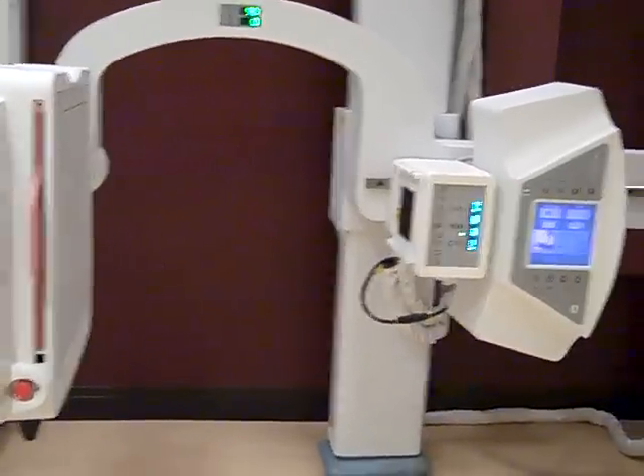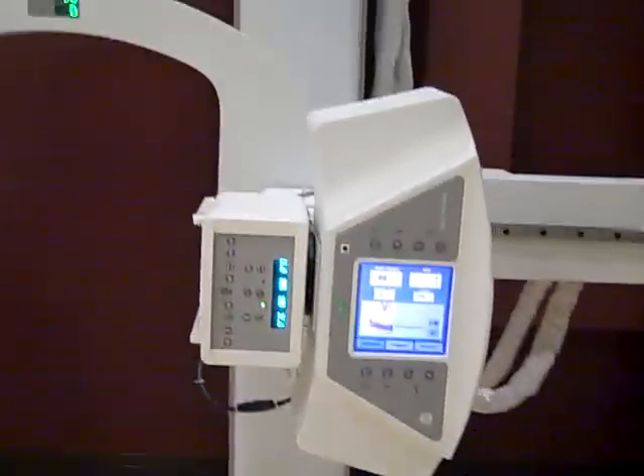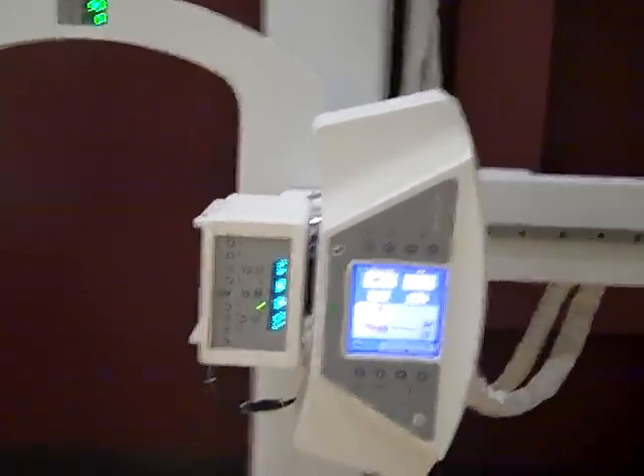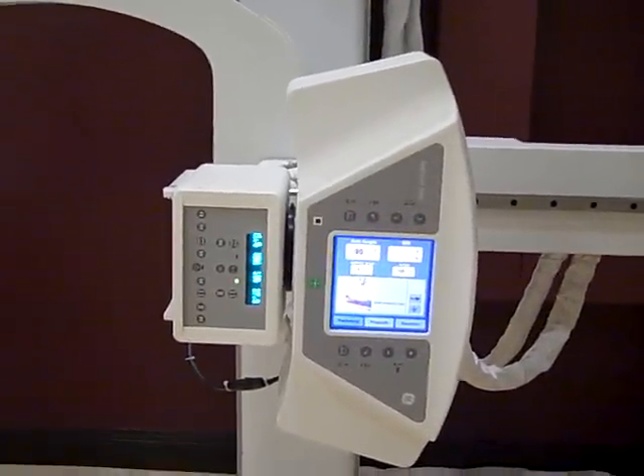This is a GE x-ray machine. It's fully digital and DR. As soon as you take your pictures, it takes about three seconds and the picture shows up on the computer monitor.